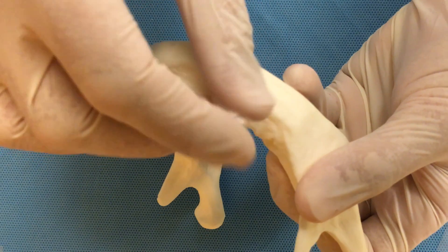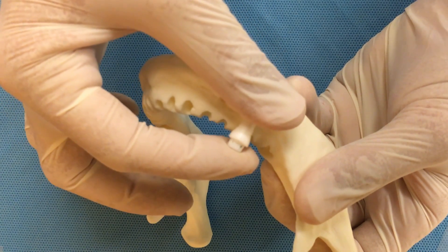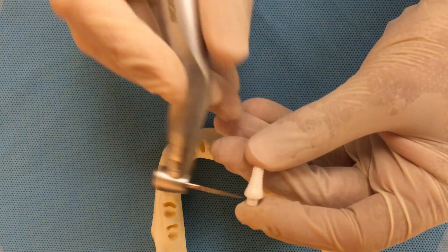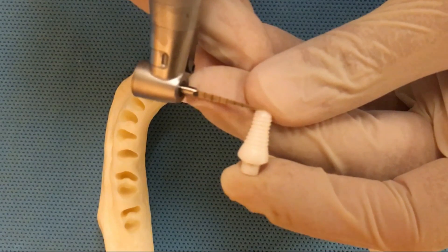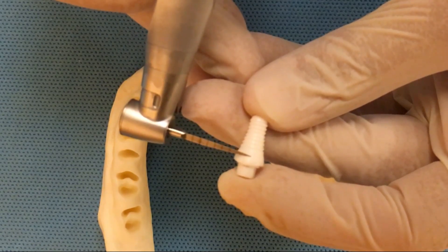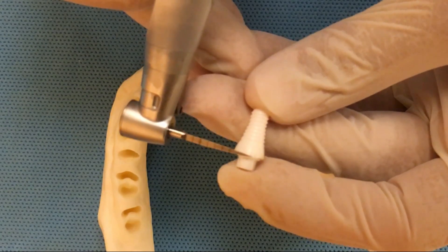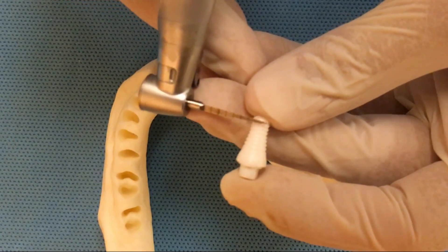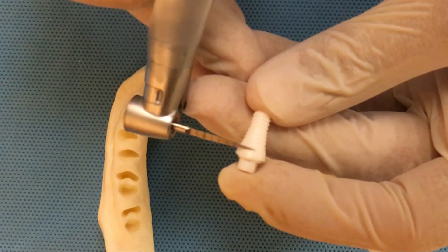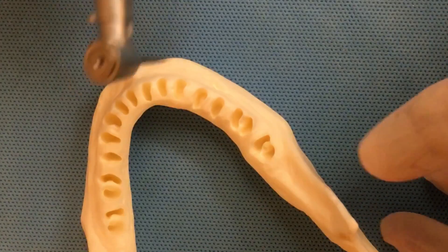This is the type of implant we have to place, and if we look sideways, this is how it should look once it is in place. This implant is a 10-millimeter implant — from apex to the last coronal thread it's 10 millimeters. We're going to drill two extra millimeters so we can adjust the position of the crestal margin. We drill 12 for a 10mm implant and then have two extra millimeters depending on the occlusal space and bone geometry.